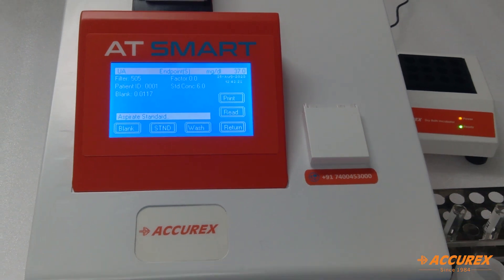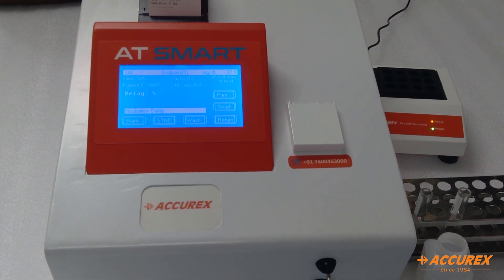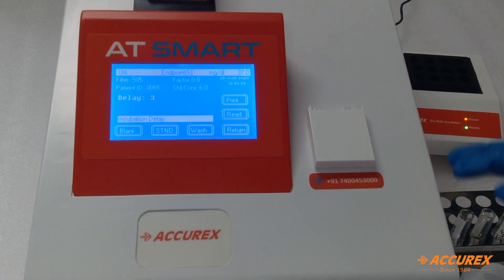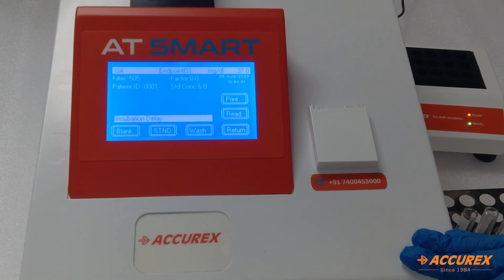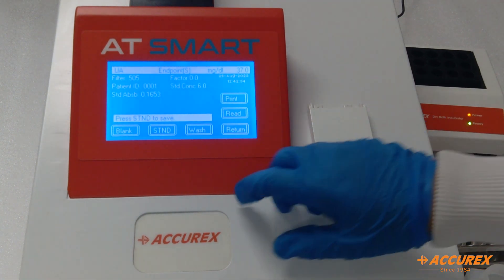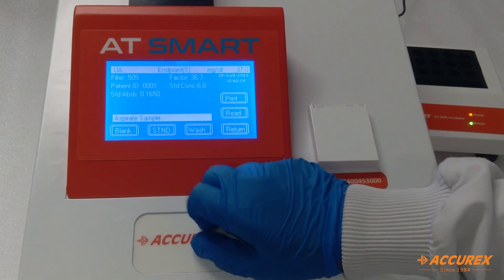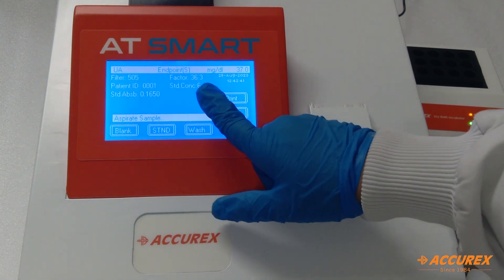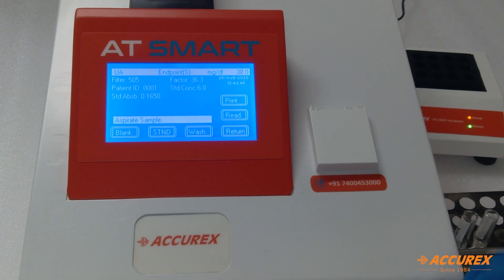Now aspirate the standard. To save the calibration, press standard once again. The factor is 36.3. Now we will aspirate the sample.